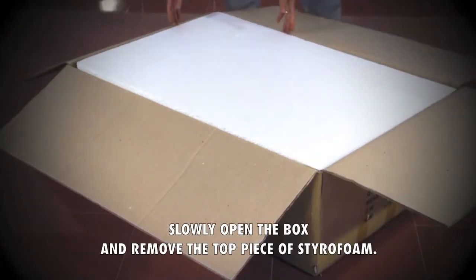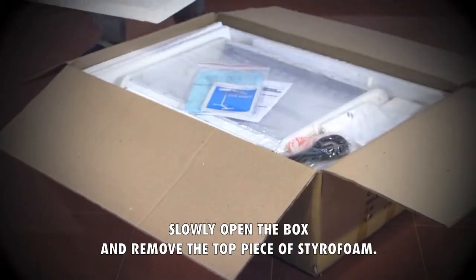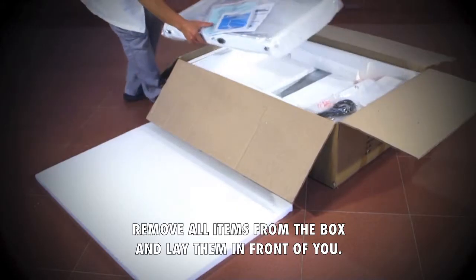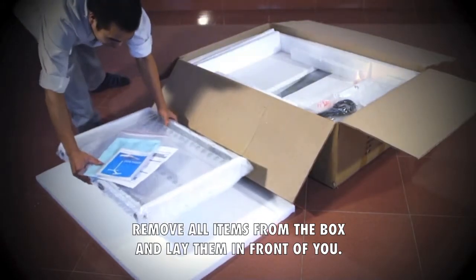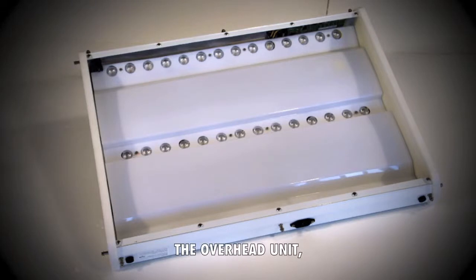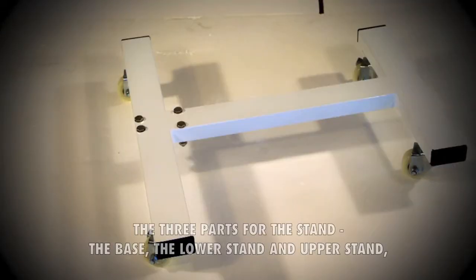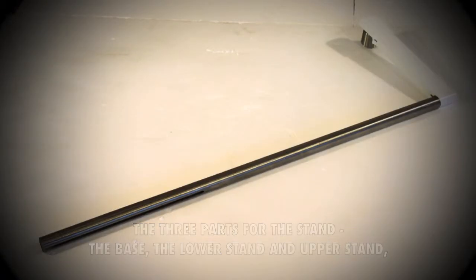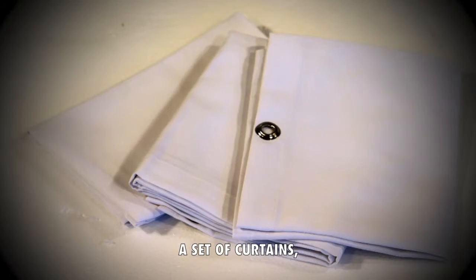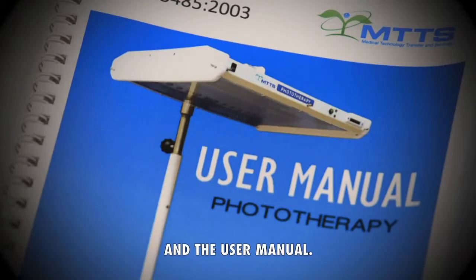Slowly open the box and remove the top piece of styrofoam. Remove all items from the box and lay them in front of you. There will be seven pieces: the overhead unit, the three parts for the stand — the base, the lower stand and upper stand — a power cord, a set of curtains, and the user manual.